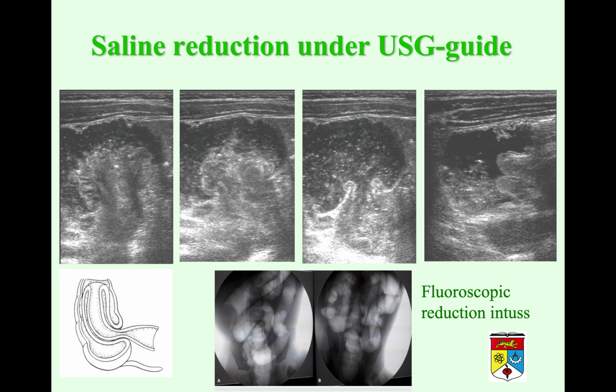Okay, so this is the ileocecal valve. Okay, so that's a thickened ileocecal valve, but whatever it is, whenever we have not seen this ileum anymore at the region of the cecum, and it has gone through the ileocecal valve, then we are sure that the intussusception has reduced and everyone's happy. Okay, no need for operation.